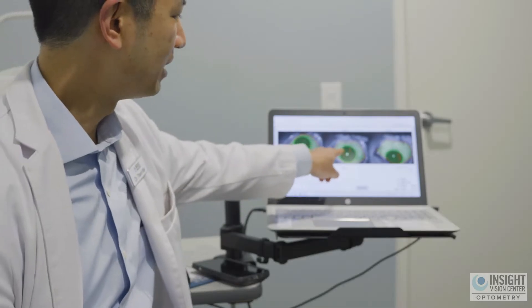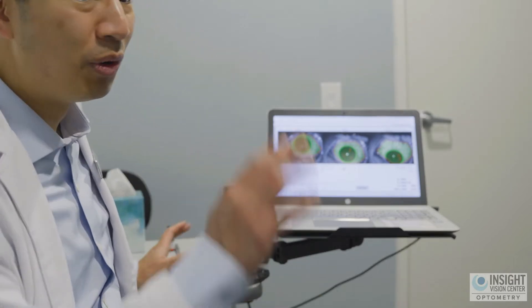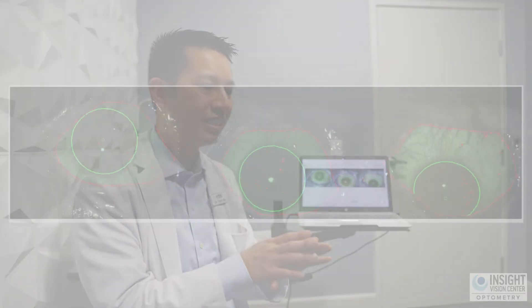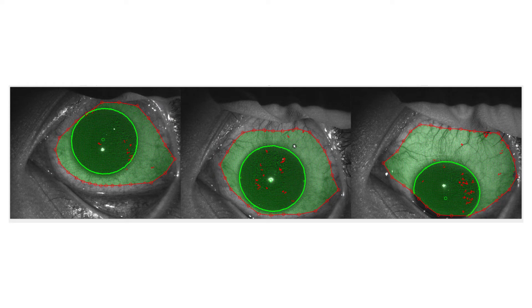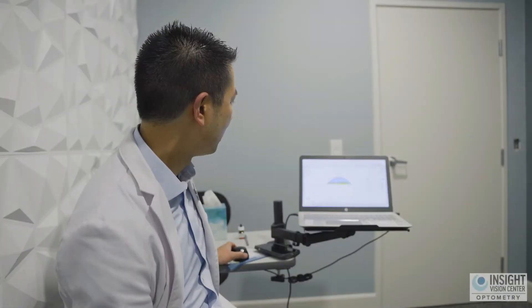We take images of the patient looking straight, looking down, and looking up, so we can capture more of the surface of the sclera. The software then takes those images and extrapolates the heights, shapes, valleys, and hills of the eye — because everyone is different — in order to design a well-fitting contact lens.